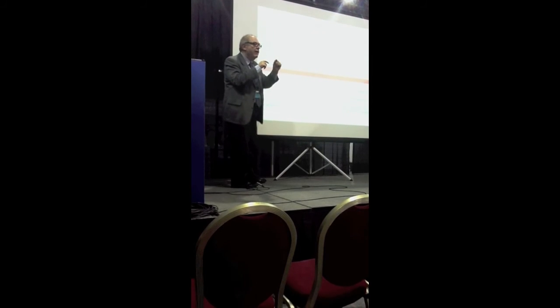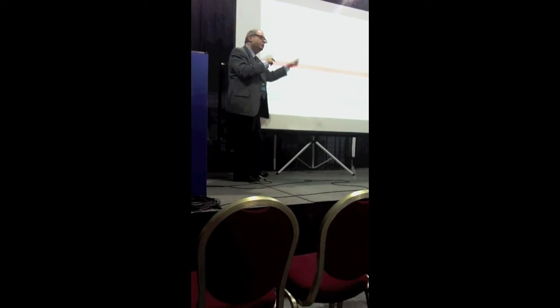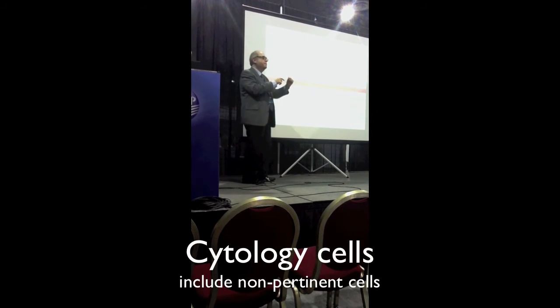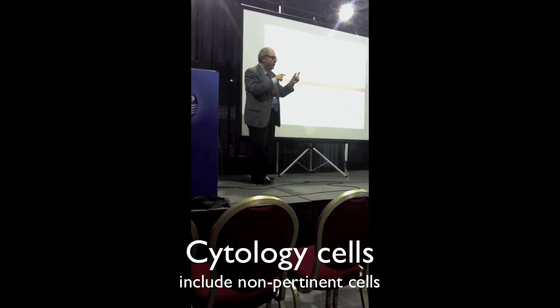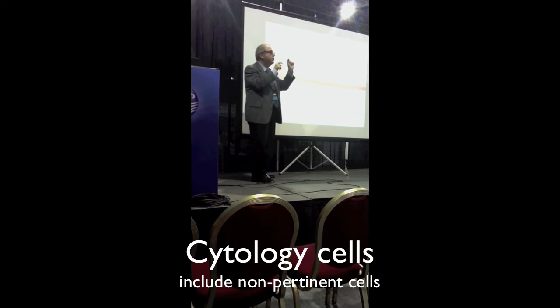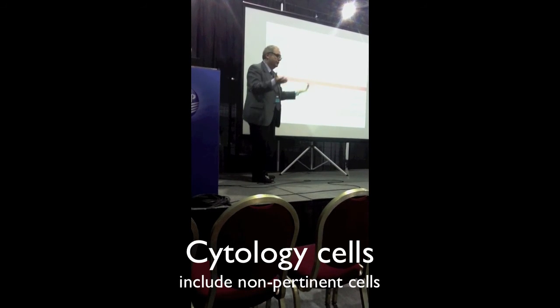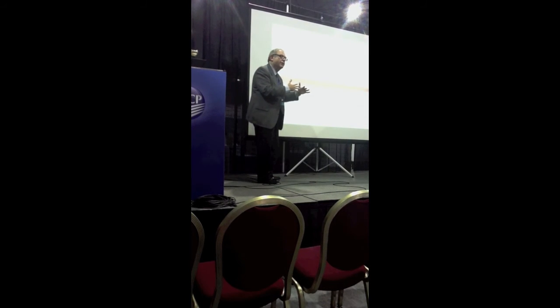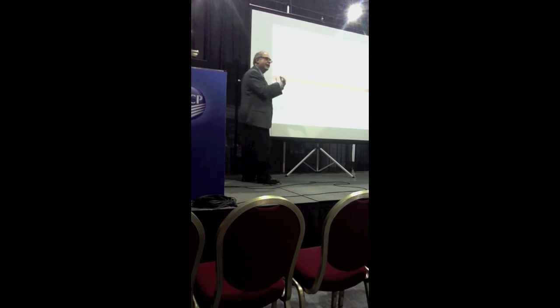You might wonder, why would the supernatant without cells be better than the actual cells? Because oftentimes the aspiration will include inflammatory cells, stromal cells, benign cells. So there's a mixture that one is dealing with. But the supernatant is enriched with the most actively growing cells.